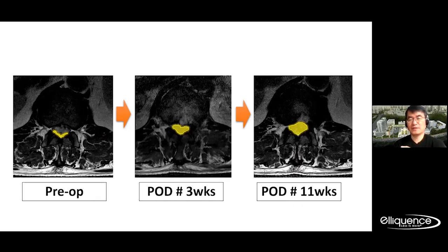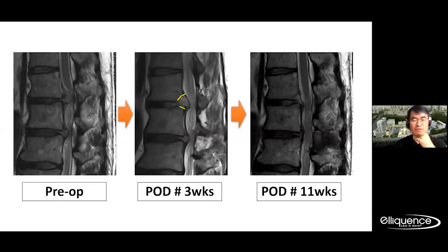The reason I followed up with this MRI, even though the patient has no neurological deficit, is that I'd like to confirm the improvement of the spinal canal. I'd like to circulate this kind of improvement image with the patient. And you can also see the resected margin of the endoscope.